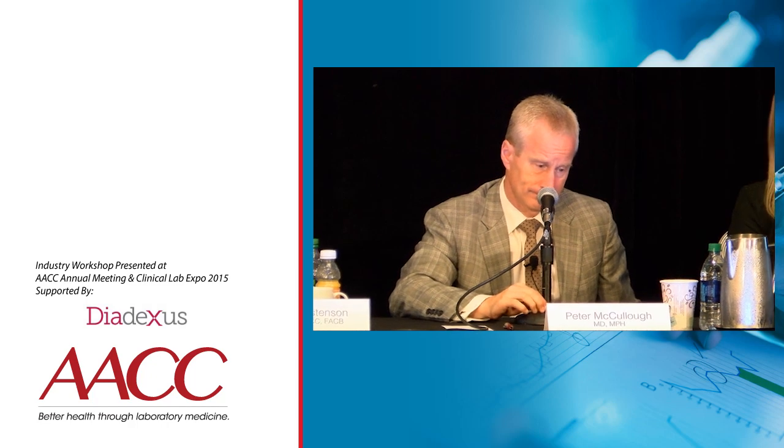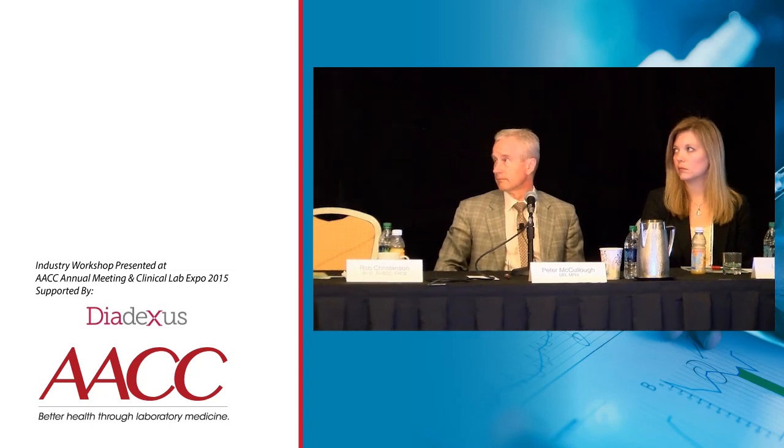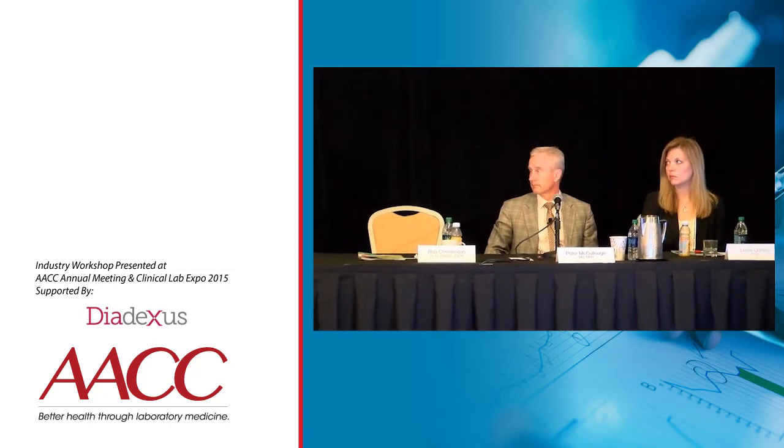It's produced by macrophages. These macrophages are resident there in the atheroma. It's physically being produced in atherosclerotic material. So it's a very good index of anatomically what's there. So one of the things that I think I've learned this morning is that the activity assay has a number of advantages, not only analytical but also clinical.